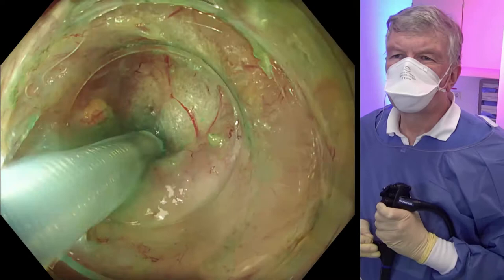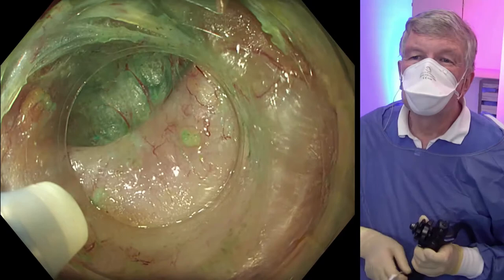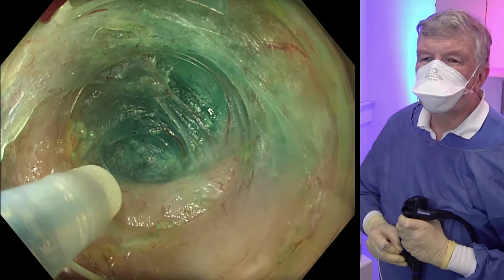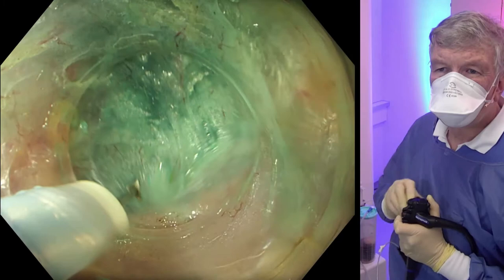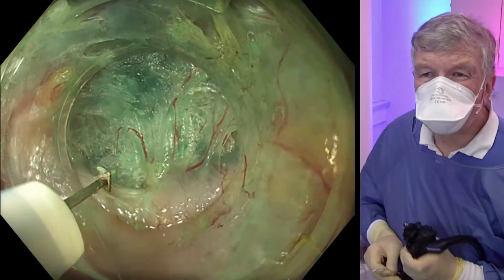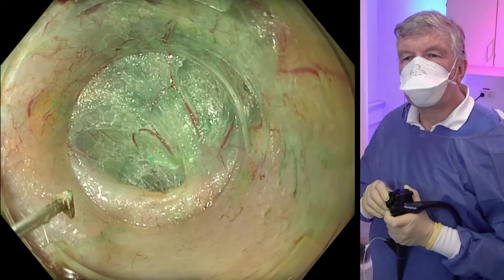You should not go too far because there is a risk of perforation of the mucosa. We add some injection fluid, and I think this is really the pylorus. We also check from the inside that the bluish injection is down to the pylorus. So this is the stopping point for gastric POEM, unlike esophageal POEM for achalasia. We do some dissection very slowly, coagulation of vessels, very cautiously with the soft coag setting. And this is the end of the tunnel dissection.